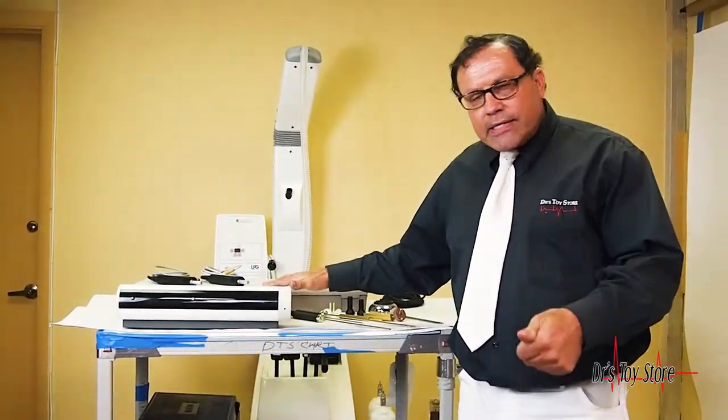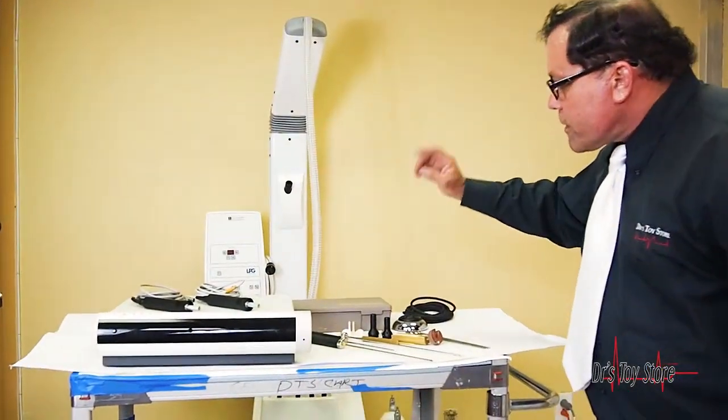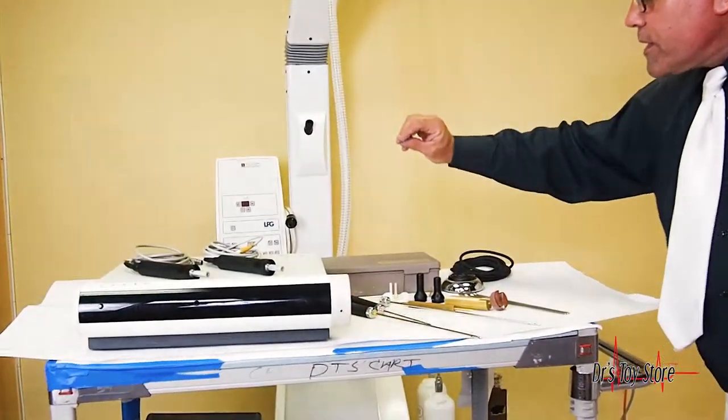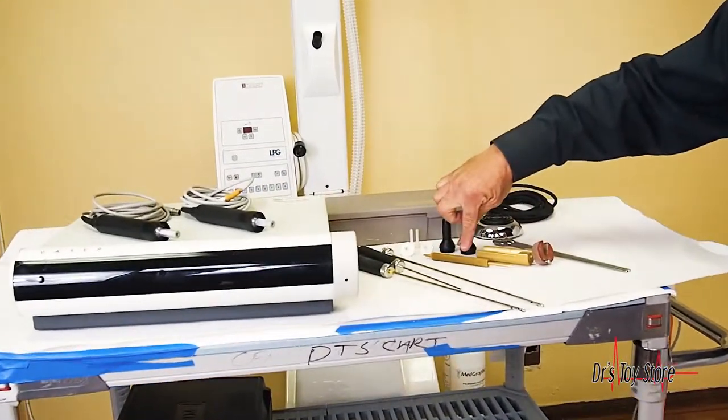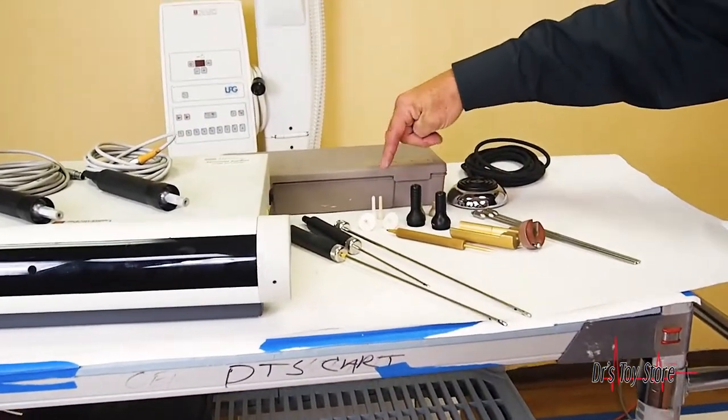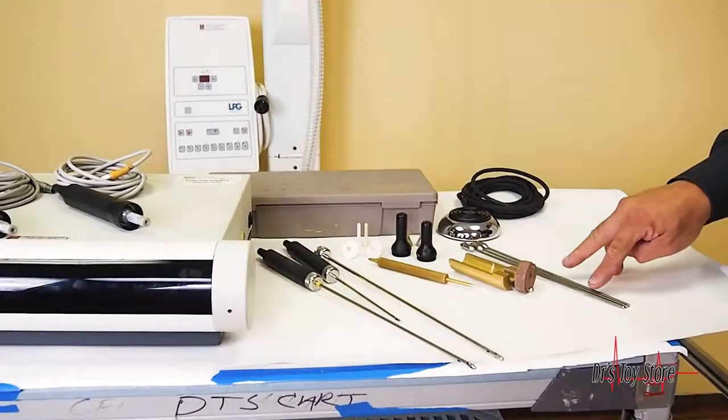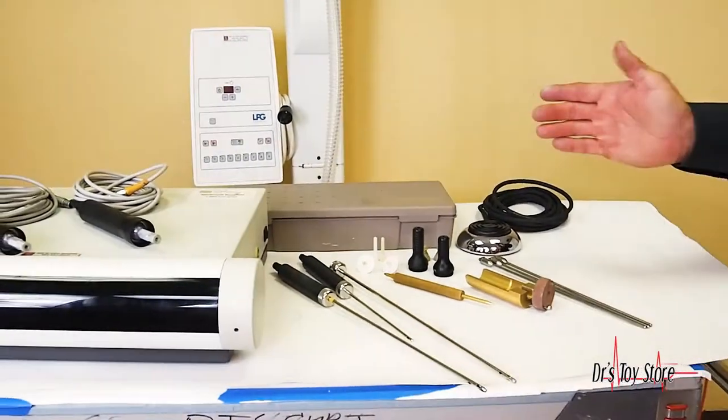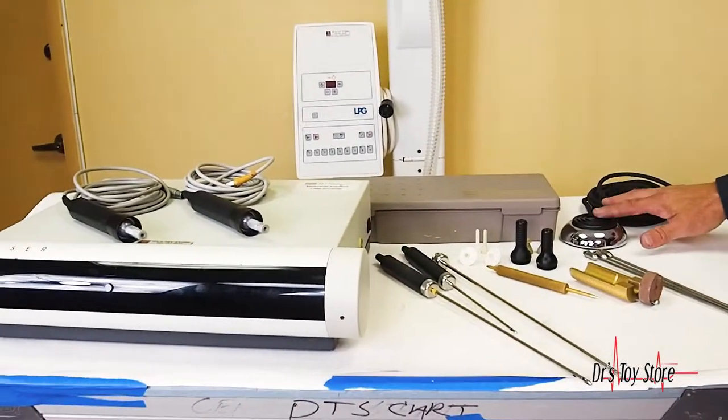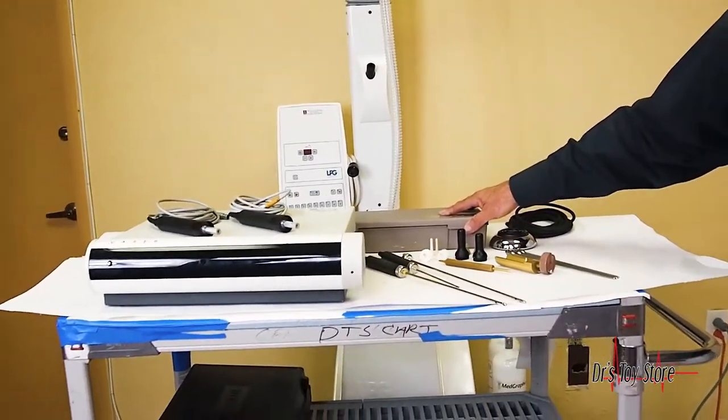These are the hand pieces. It comes with two hand pieces, infiltration cannulas, the skin piercing device, the skin ports, the locking device, the nose cones, three tips. We can adjust the tips either way. The foot control and the autoclavable box to sterilize everything.